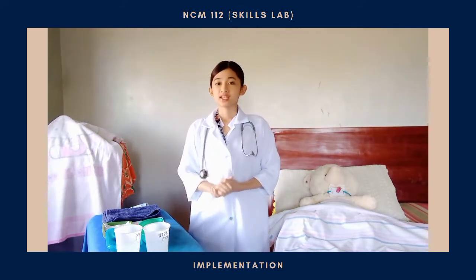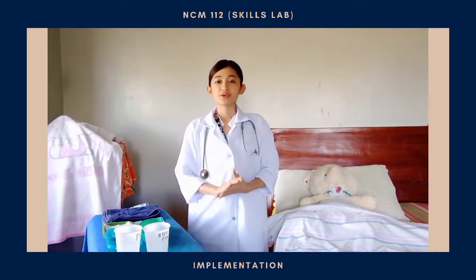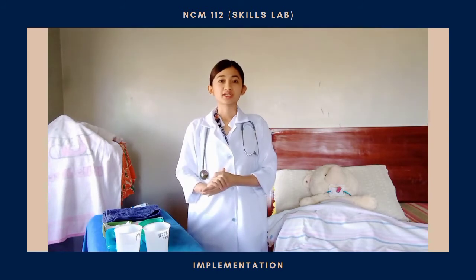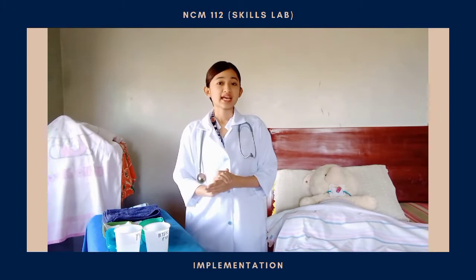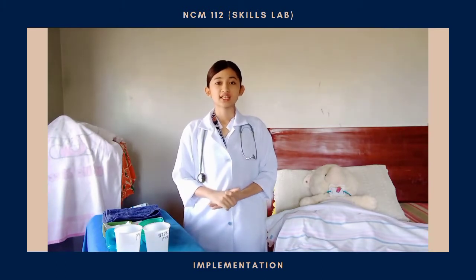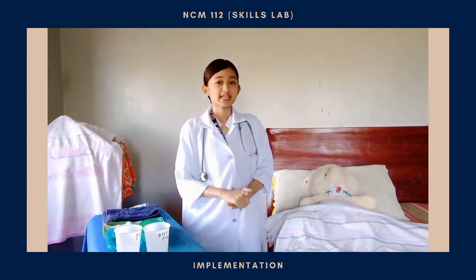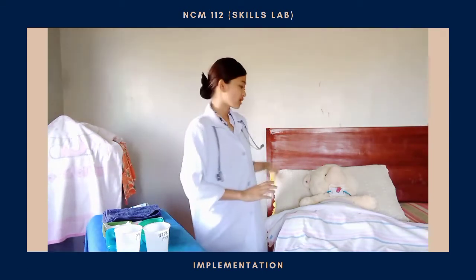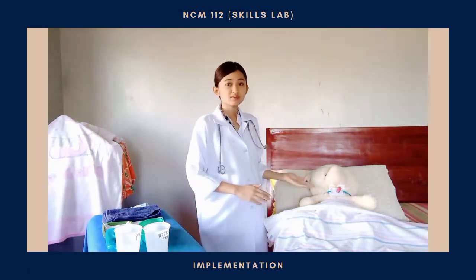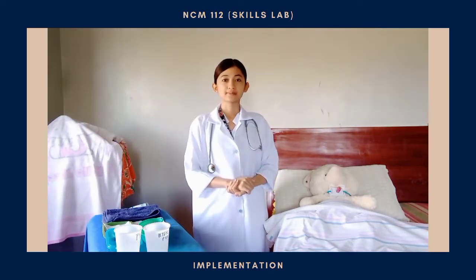Then, determine the need for tracheostomy care. And we can do this by reviewing our patient's chart prior to going into her room to determine the last time and date of when the tracheostomy care was performed. Then we can assess the client's oxygenation status by using a pulse oximeter. And we can also evaluate the tracheostomy site for any wetness or any secretions.